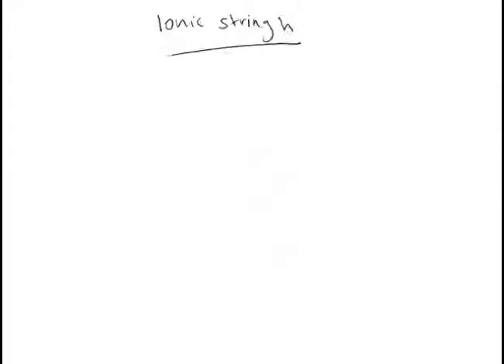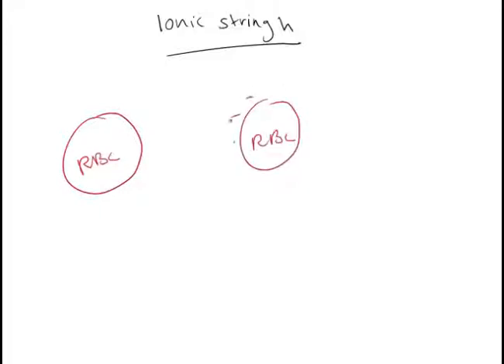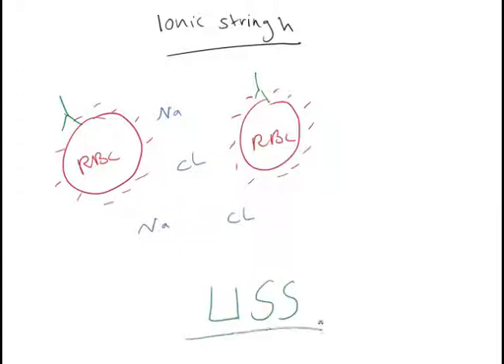If the ionic environment is reduced, so there is a lower amount of ions, this shielding effect is reduced and the amount of antibody uptake onto the red cells is increased. So we will talk later about how to use low ionic strength saline to enhance the agglutination, and it works by this principle.